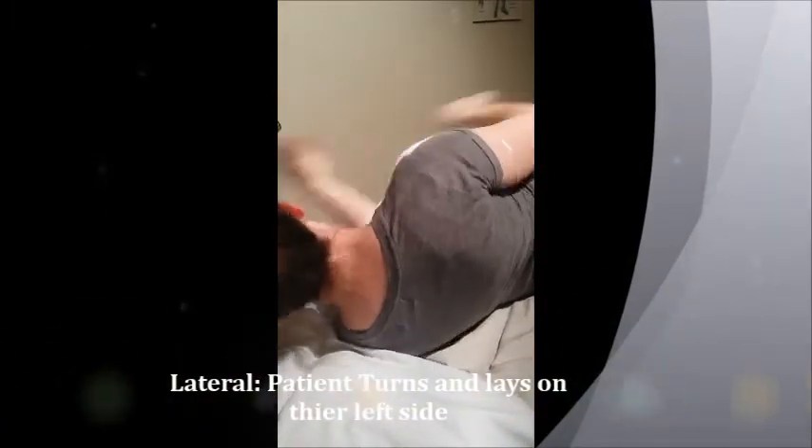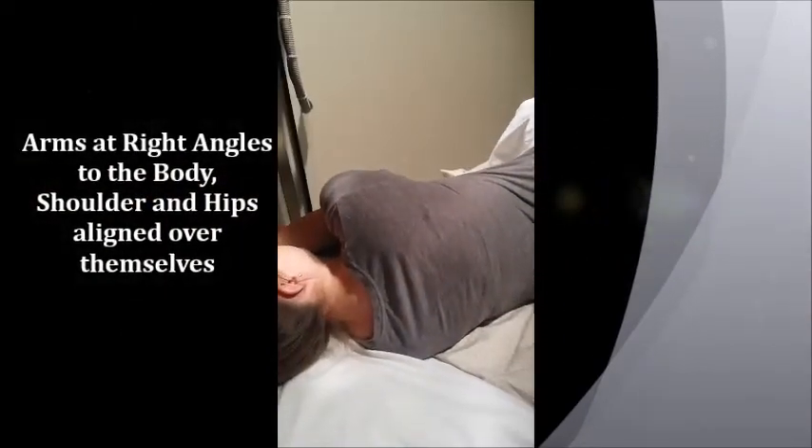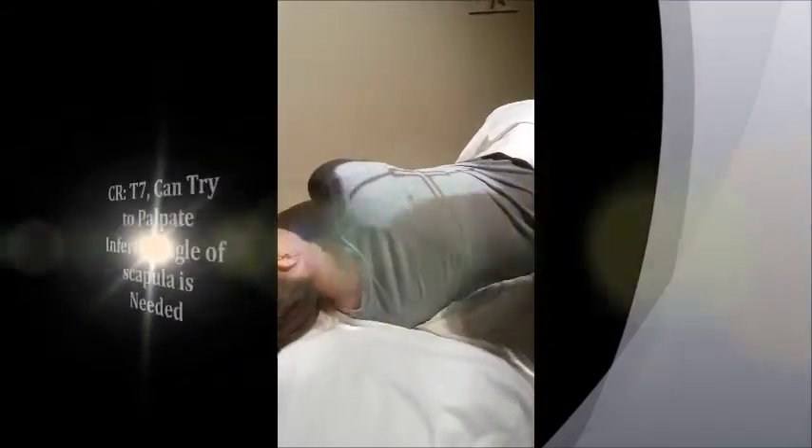Now I'm going to have her turn and lay on her left side. Her arms will come up kind of in a sleeping position, at right angles to her body. We're going to make sure she's still shielded, and her hips are over one another so everything is in a straight line. Same thing with her shoulders — you want them right over each other.